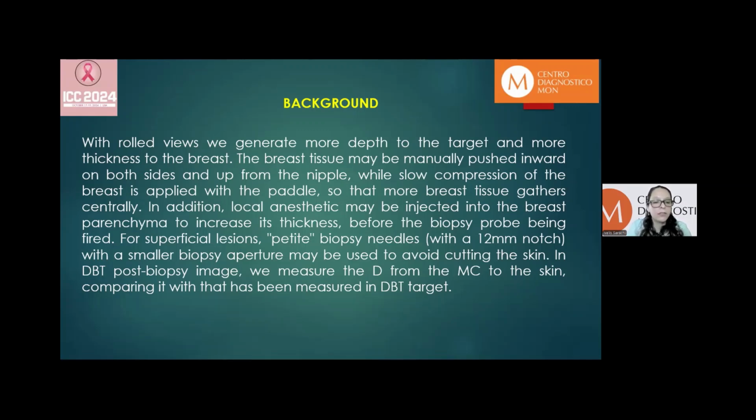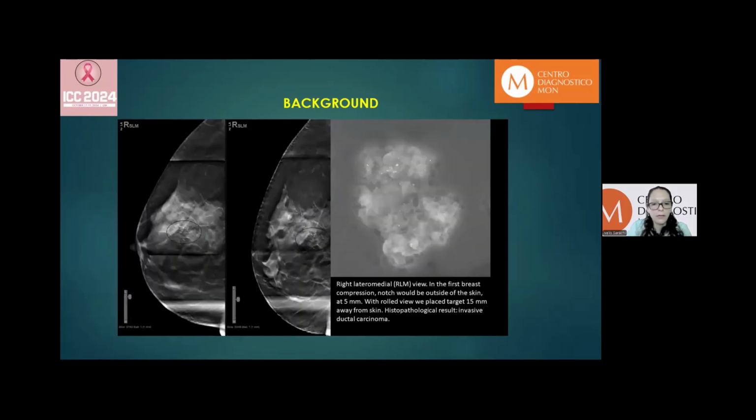In the DBT post-biopsy image, we measure the distance from the marker clip to the skin, comparing it with that which has been measured in the DBT target. This is an example. A right lateral view.